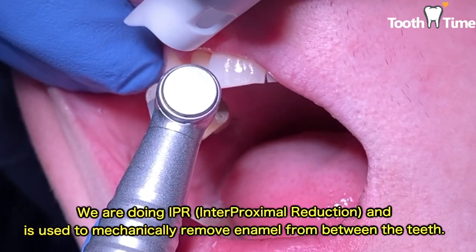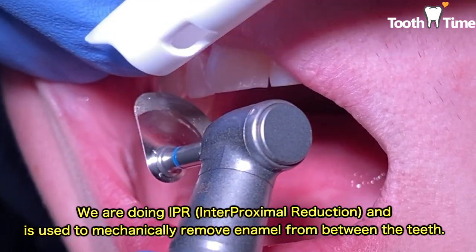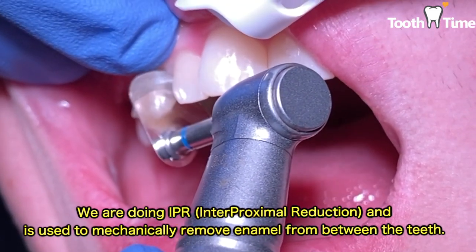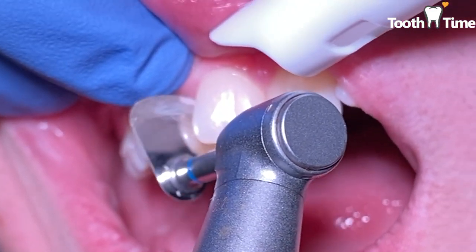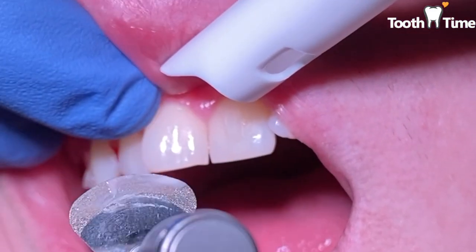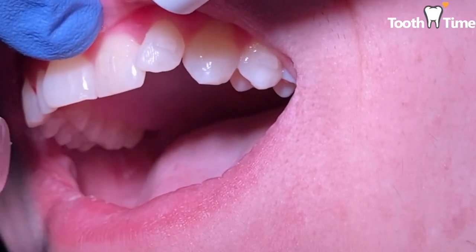This appointment we did IPR. IPR is interproximal reduction, which is just reducing in between the teeth just about a hairline millimeters to create some space to help align and rotate the teeth while in clear aligners.